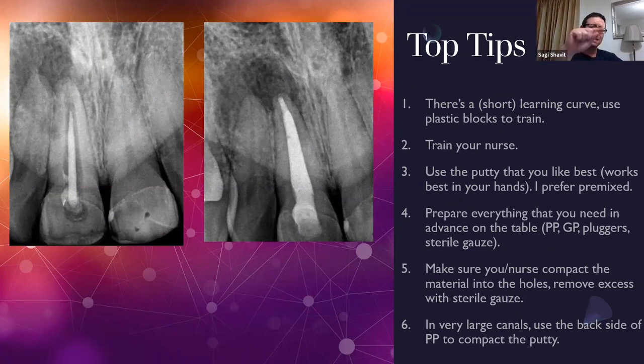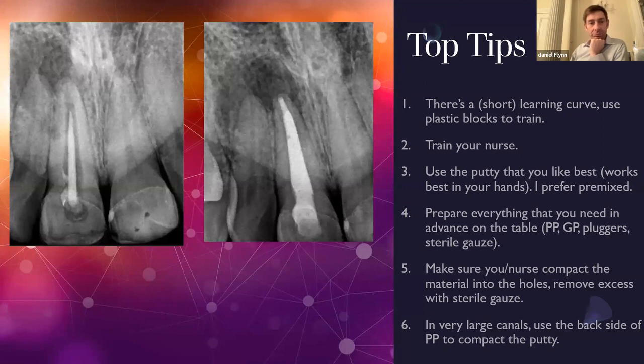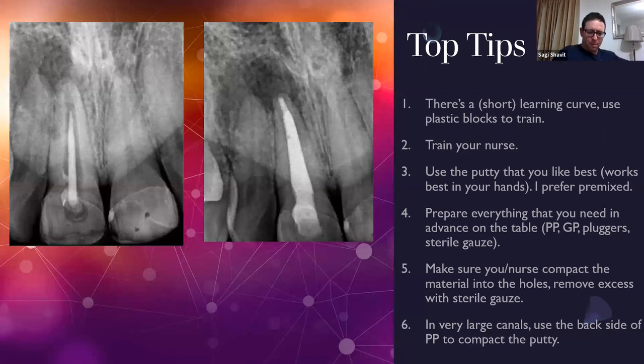By the way, this is the case that I mentioned. It's not my case. A dentist did this retreatment. First time using the pellet former, and I think it looks amazing. Fantastic. All I did is sit with him on the phone for maybe 10, 15 minutes, explained to him exactly what to do, just like I did today, and he did that. So, top tips: how to repair or do apical plugs or repair perforations with the pellet former.